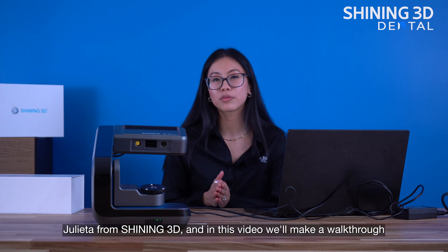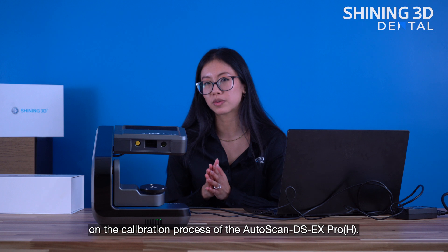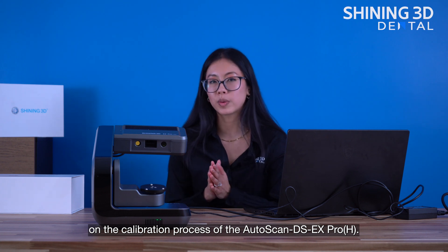Hello, this is Julieta from SHINING 3D, and in this video we'll make a walkthrough on the calibration process of the DS-EX Pro(H).